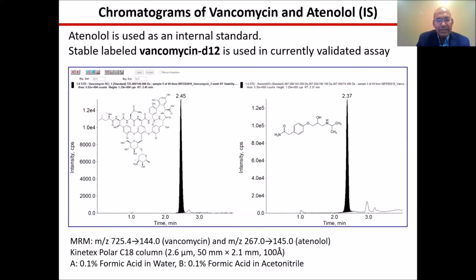Some of the information on the mass spec conditions and the chromatographic conditions is listed below. This method has been very robust in working with small volume blood samples.